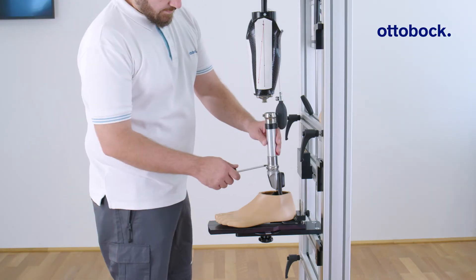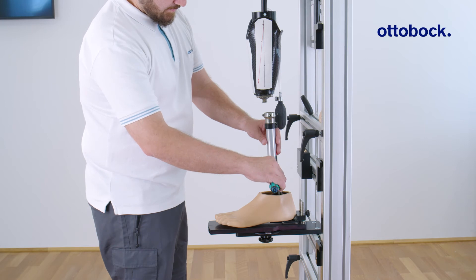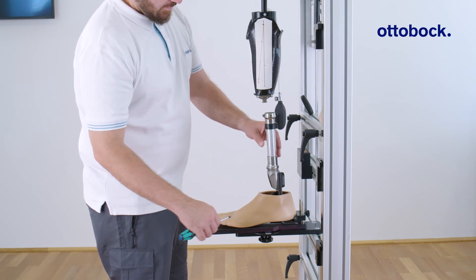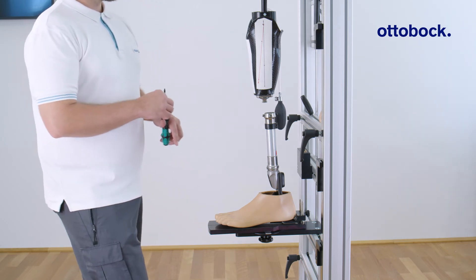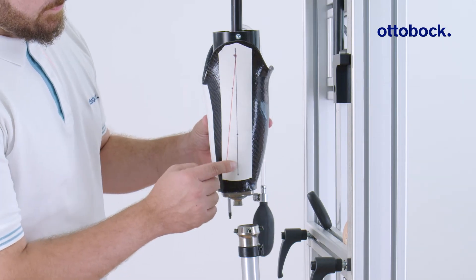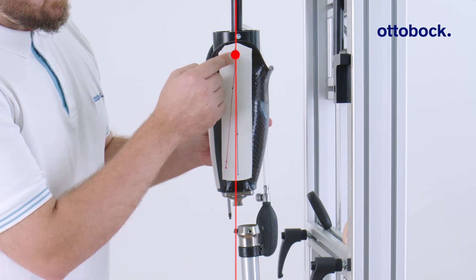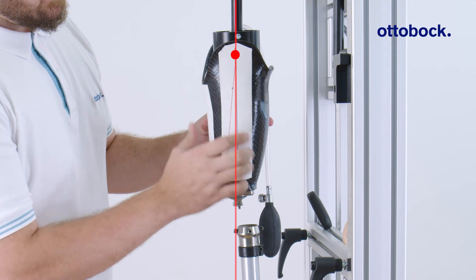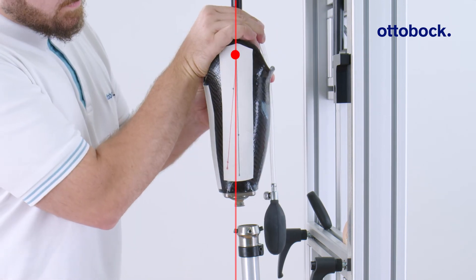Connect the prosthetic foot with the prosthetic socket using appropriate adapters. For socket flexion, the alignment reference line should run centrally through the prosthetic socket reference point. Then adjust the socket flexion as needed.